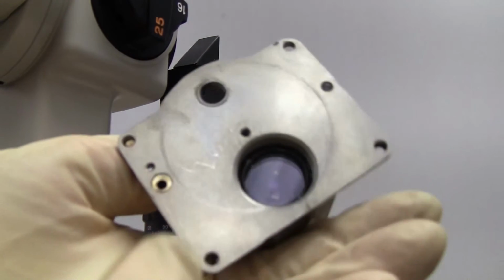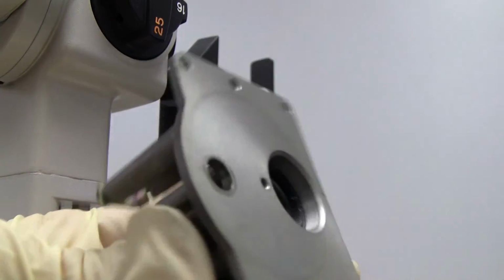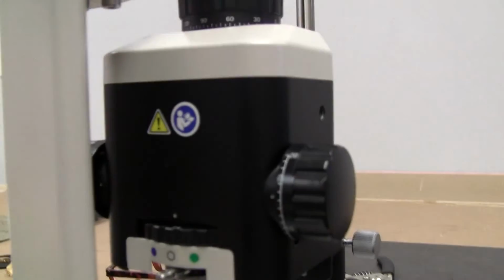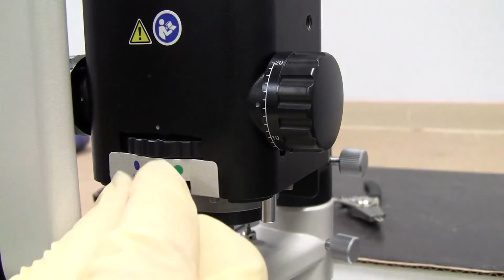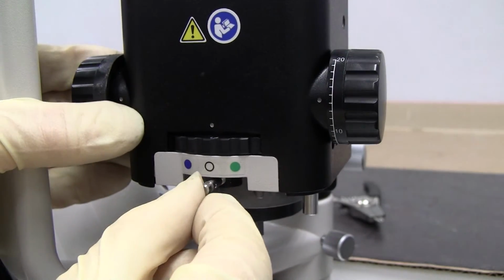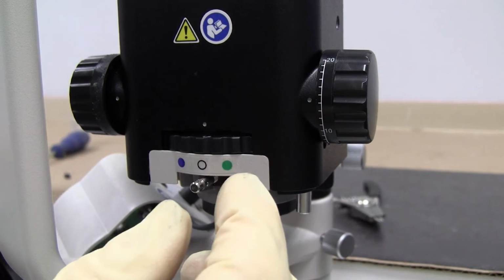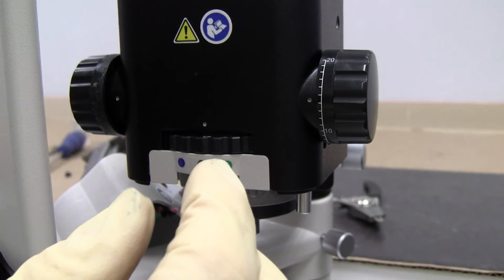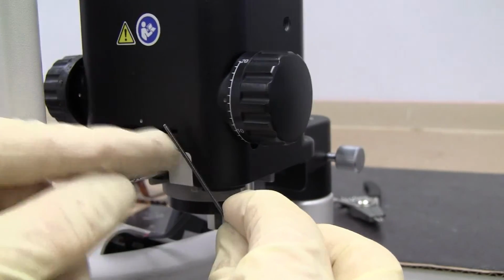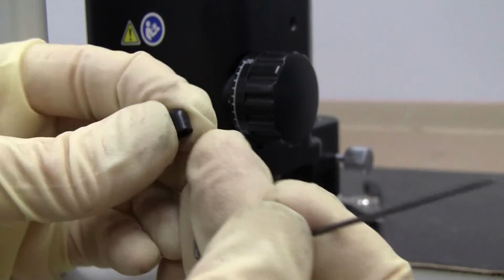If possible, don't go into here. Don't loosen these screws and go in there. Hopefully your only issue with your handle will be that it just needs to be aligned and retightened. And once you have it tight and you've gotten it tight with your lever, then put your cap back on.